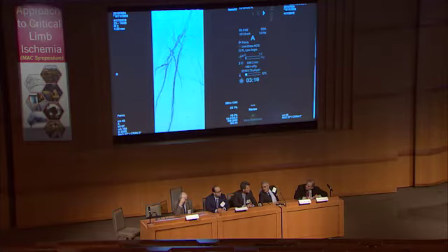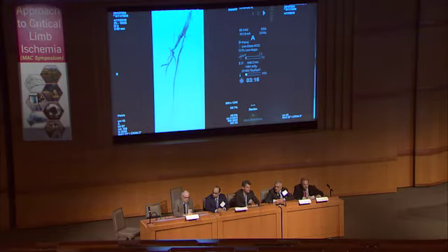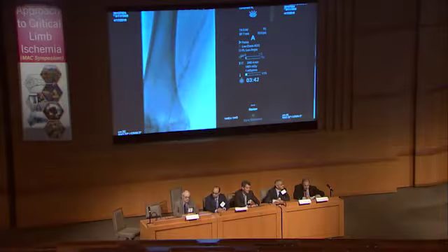How about the rest of the panel? How would you treat this? Well, basically, I would do the same as Andre mentioned, to use a short 6 millimeter balloon to further prepare this focal highly calcified area, because otherwise the Supera will not open. I would say the remaining SFA looks pretty good, except the origin. I would reserve the Supera only for the distal SFA, including the calcified chunk, going down to the P2 level and the SFA.